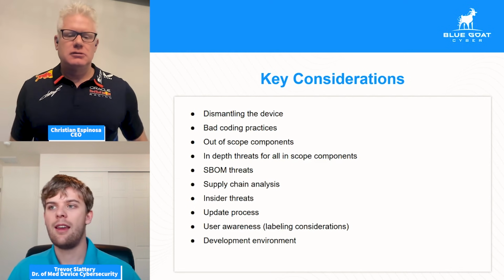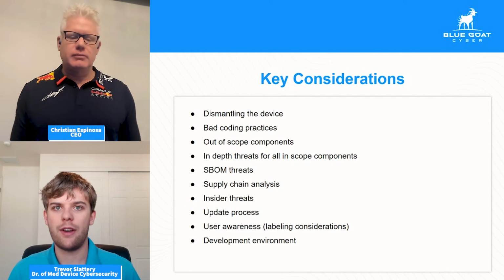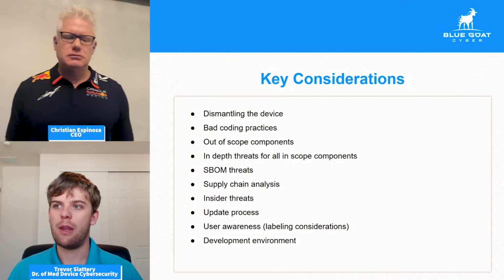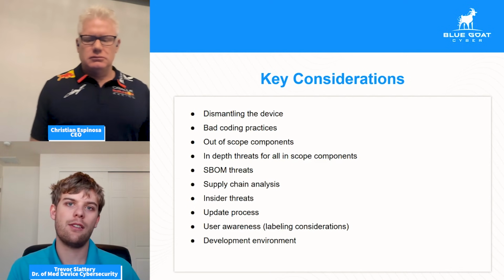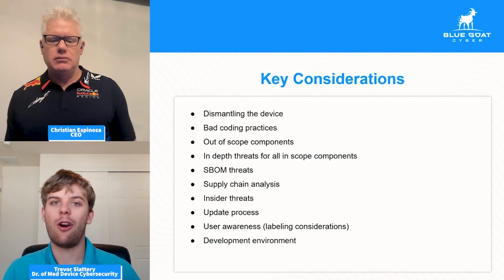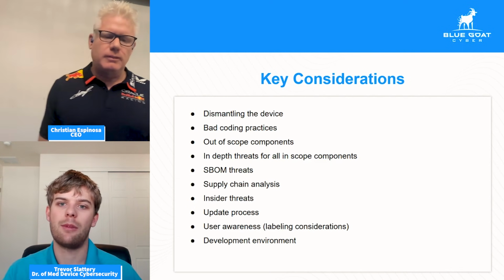And of course, like I said, this is a general list. This is not meant to be comprehensive for everything that can happen to a device. Every device is unique, and we have to recognize that and be informed on what can happen to the specific use case, to the specific component. So that's part of where all the hard work with threat modeling comes in, is understanding everything that can go wrong to a unique system that you may not have seen before.